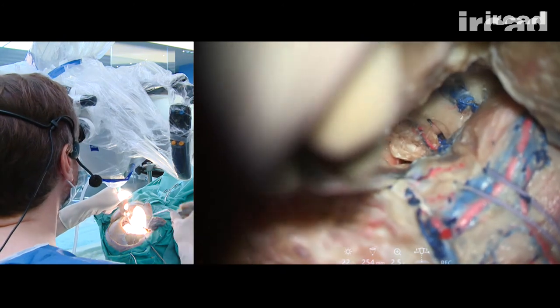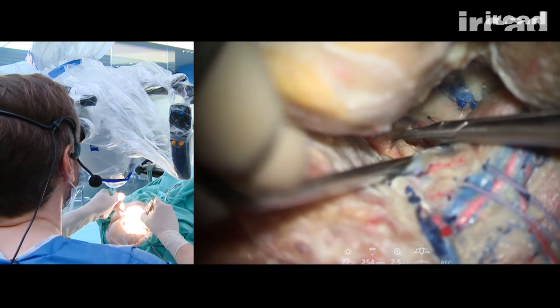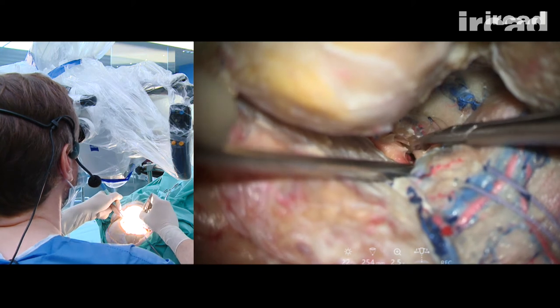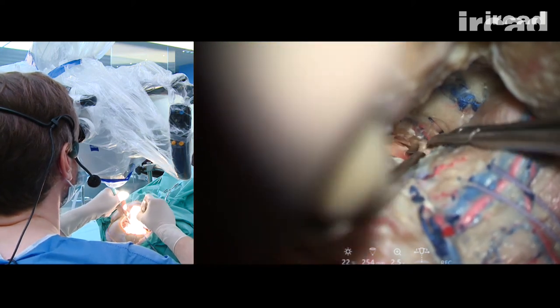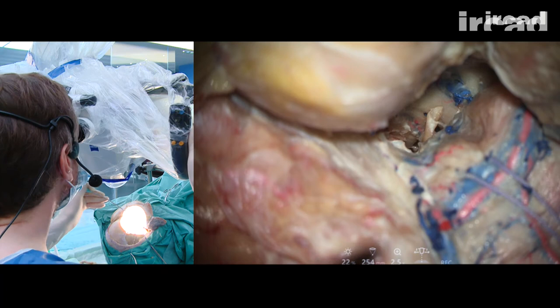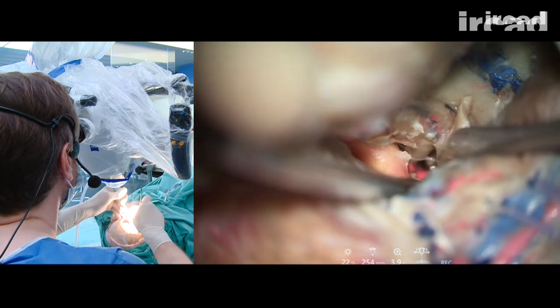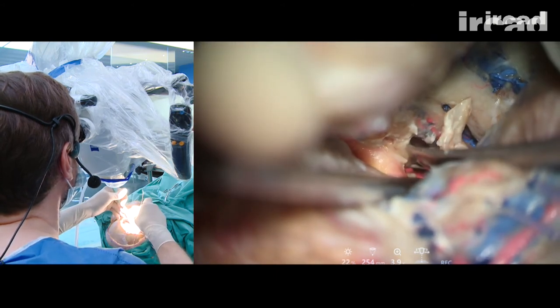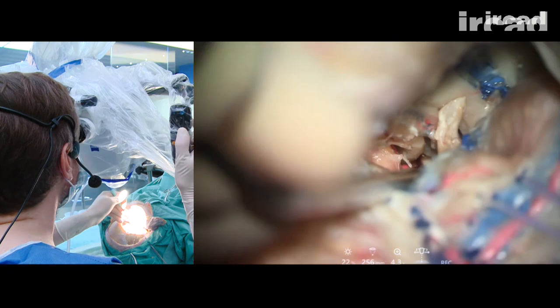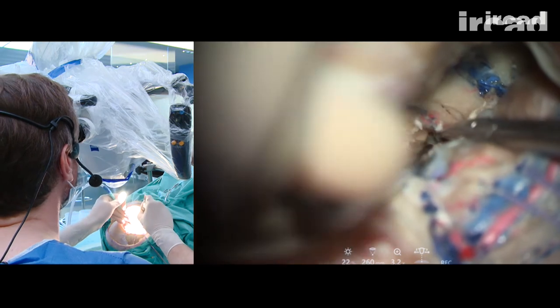I can open here the ring of the oculomotor foramen. Here it is. So oculomotor foramen with third going into the cavernous sinus. You can see that once I have opened oculomotor foramen, I can mobilize third to gain space, to have access lateral to third here.